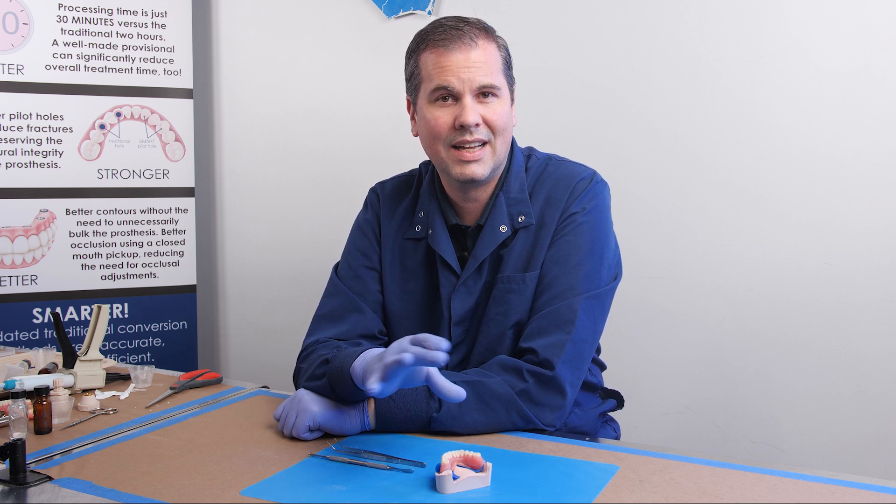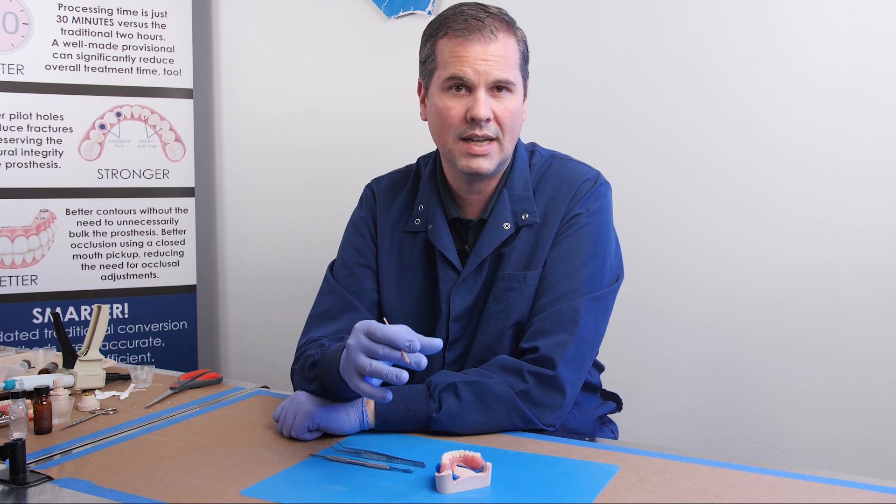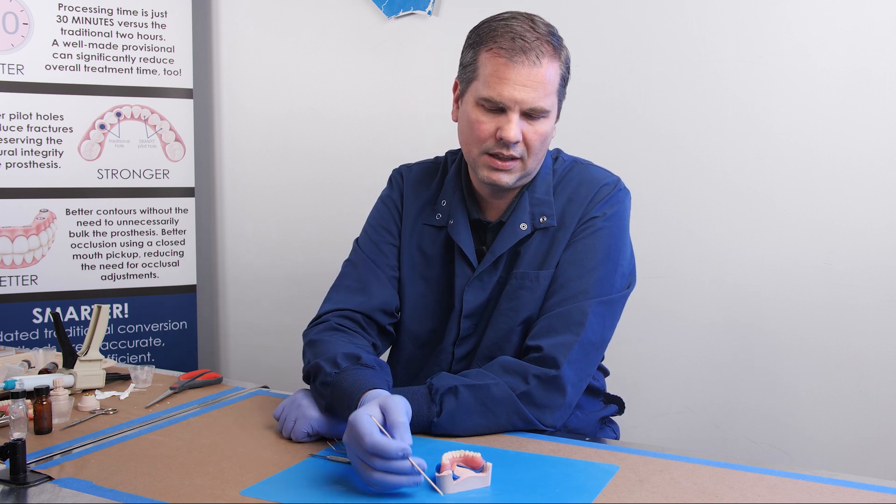We're going to use that as kind of like a healing abutment, so we're going to reassemble a new head to that screw, which we call a press-on cap.